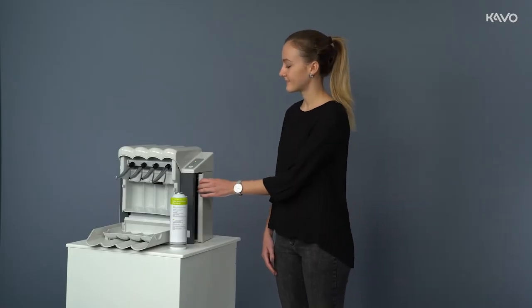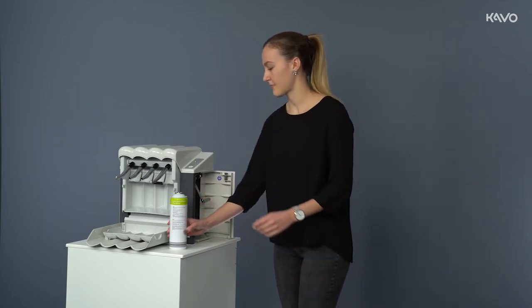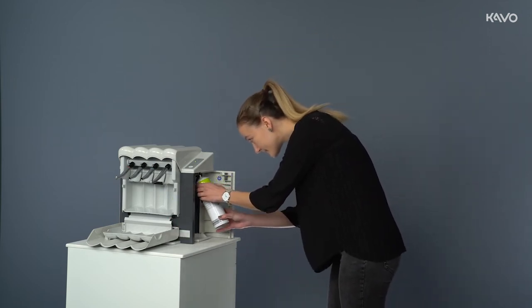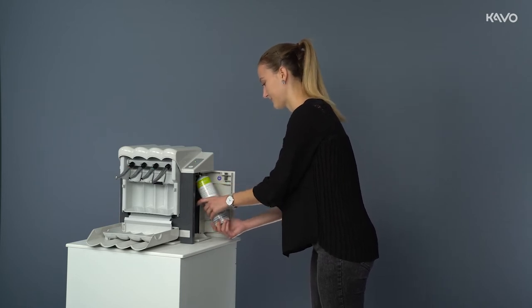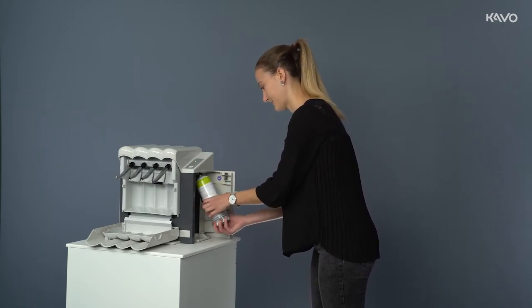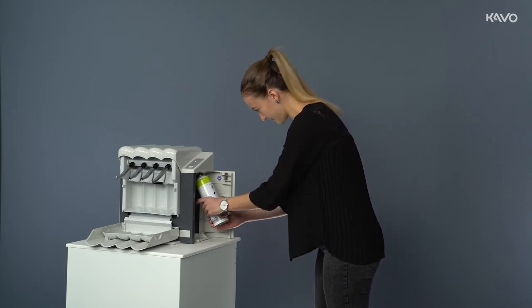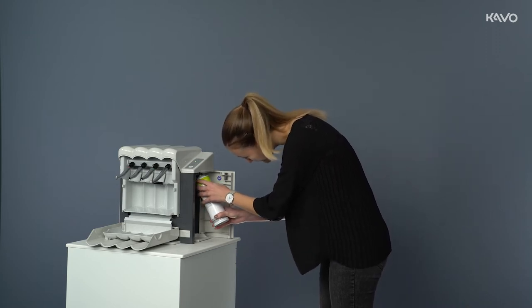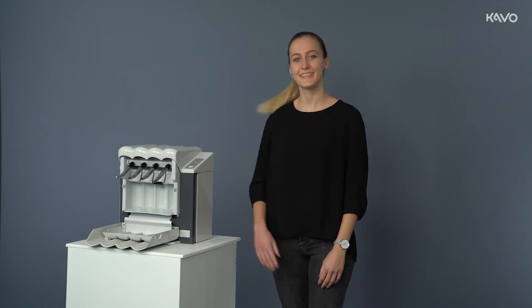To position the spray can ready for use, open the side door of the unit, swivel the adapter on the holding bracket outwards, place the spray on the holding bracket and then screw in the spray container clockwise until you feel resistance. Then check the screw connection, swing the spray container and the adapter back into the device and close the side door.